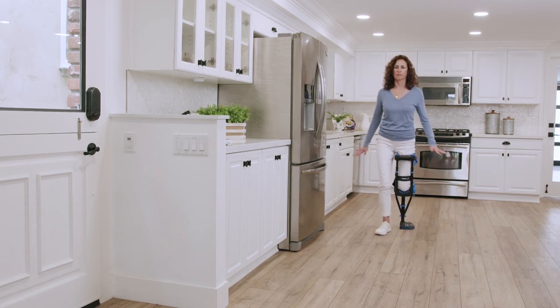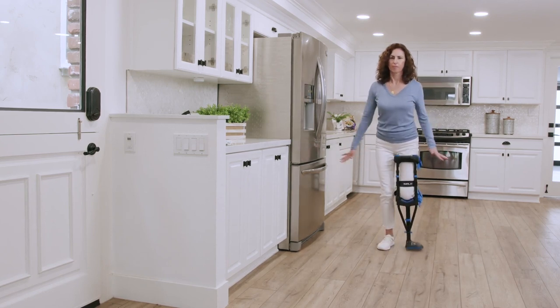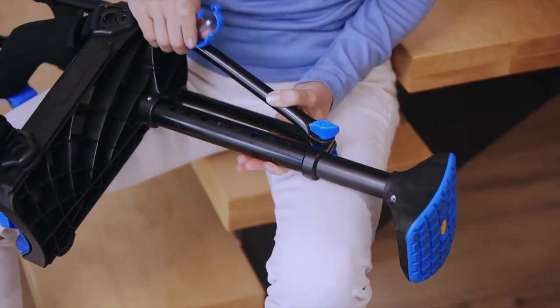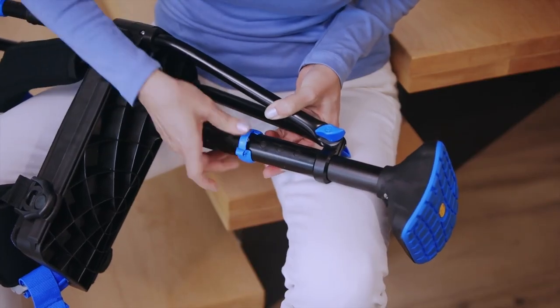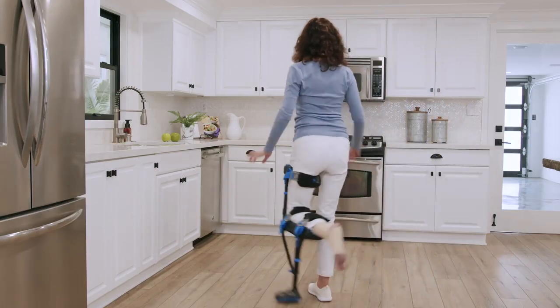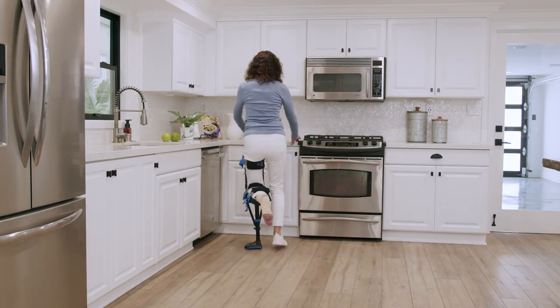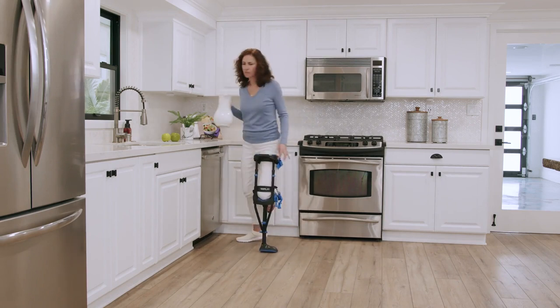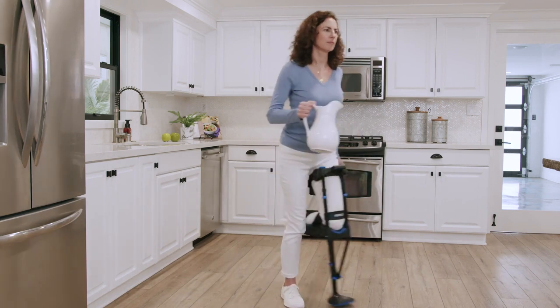As soon as you're feeling confident, let go of the handle and let your arms swing naturally. When you're walking fluidly, you should restore the lower height adjustment to give you equal leg length. The crutch should immediately feel more efficient now that your legs have equal length. If you're feeling fatigue in your good leg, glutes or lower back, that's normal and will resolve as you adapt. Give it some time.